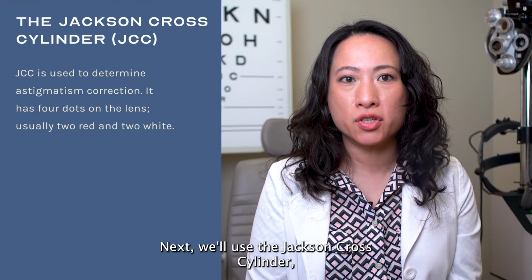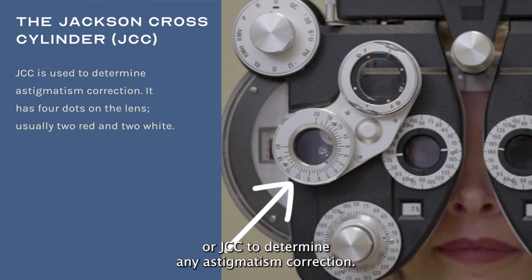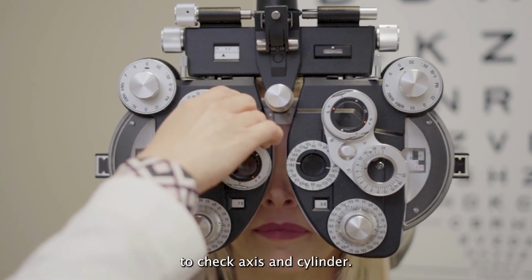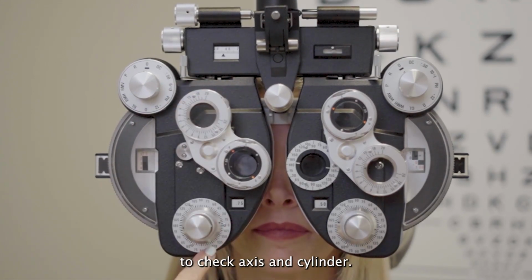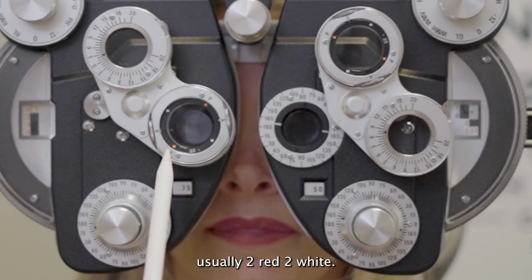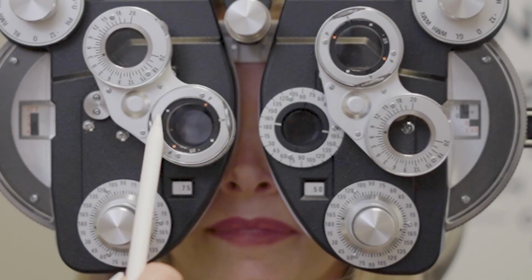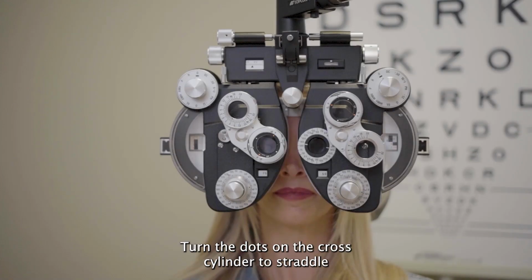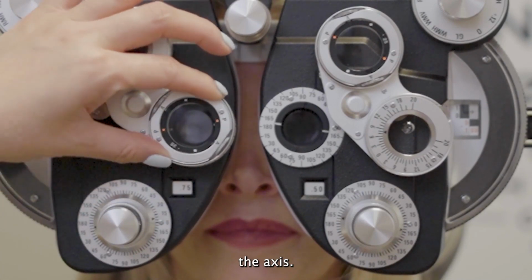Next, we will use the Jackson Cross Cylinder, or JCC, to determine any astigmatism correction. Flip the Jackson Cross Cylinder in place to check axis and cylinder. It will have 4 dots on the lens, usually 2 red and 2 white. Refine the axis first. Turn the dots on the cross cylinder to straddle the axis.